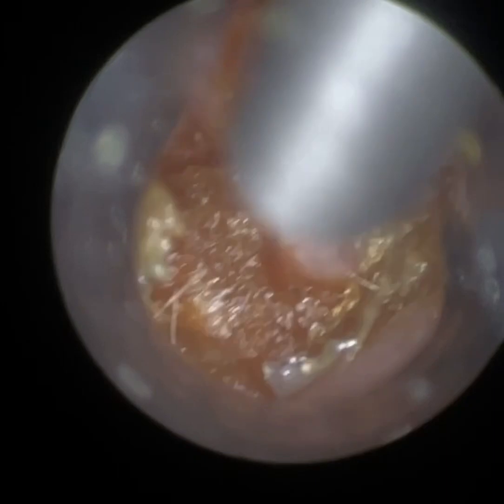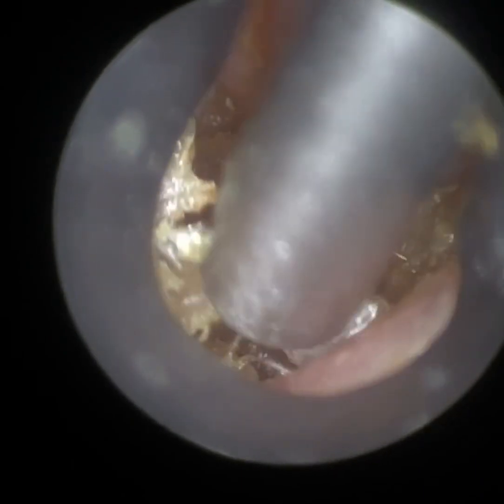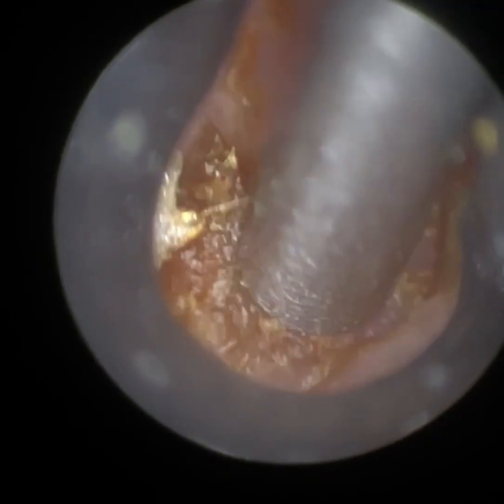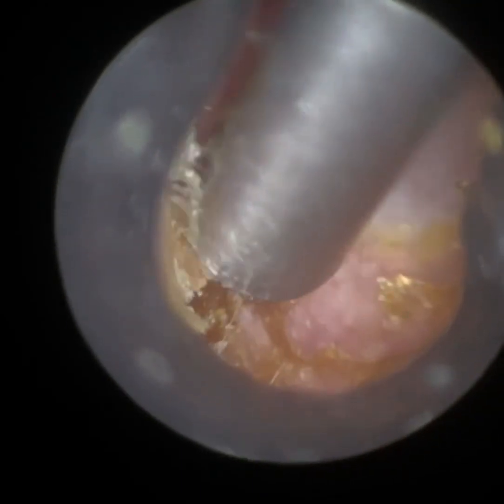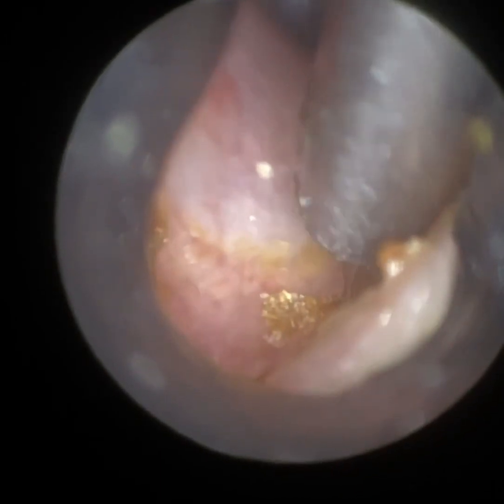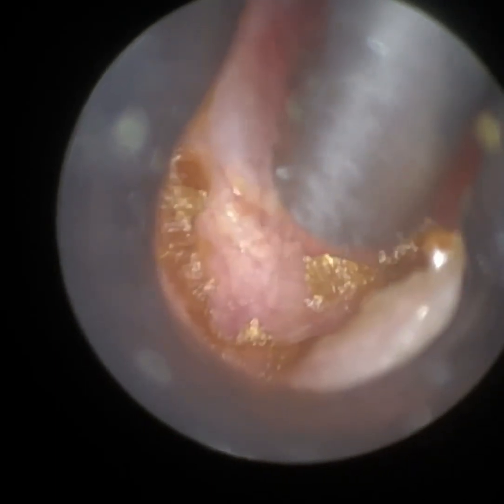We've just got some dead keratin at the base of the ear canal here, so we've got to be careful — we don't want to bump into the canal and make it uncomfortable, so we've got to hover over. This is where the Waxscope really gives you a great line of sight because there's no overlapping or obstruction with the instrument along the optical axis. If the instrument isn't inserted correctly, it can go directly in front of the camera — what we call the optical axis — causing distortion and obstructing the view.